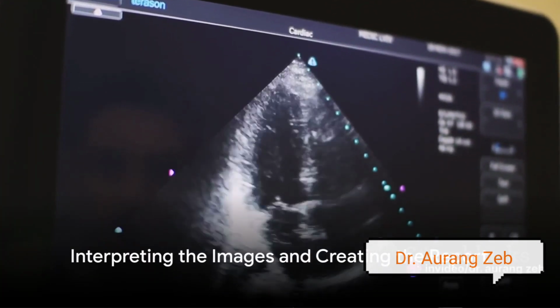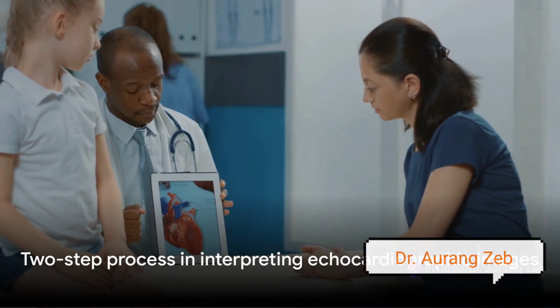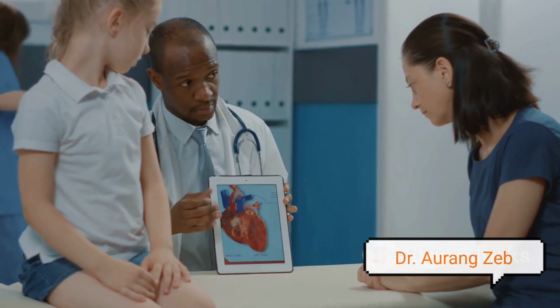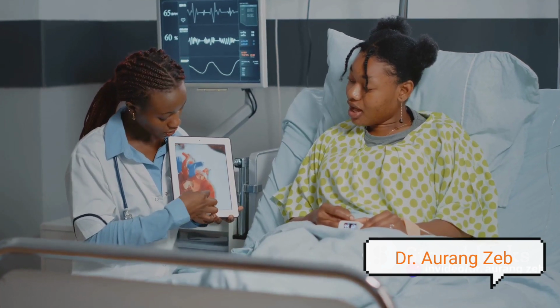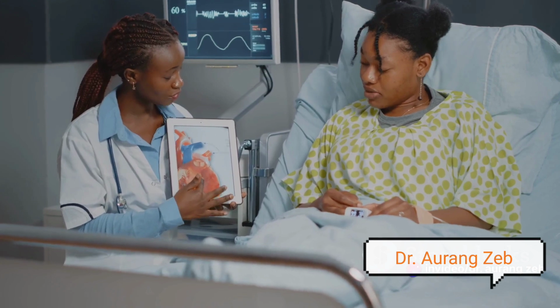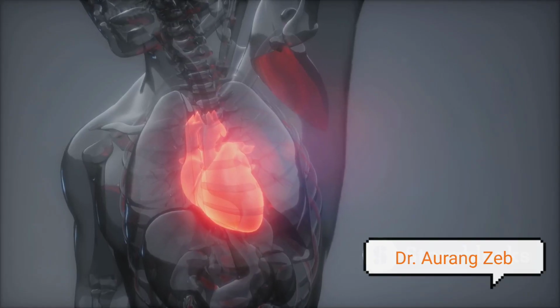Interpreting the echocardiogram requires skill and knowledge. Let's delve into how this intricate process unfolds. Firstly, the interpretation of echocardiographic images is a two-step process. The first step is identification, where you need to recognize the anatomical structures and the echocardiographic views. The second step is analysis, where you assess the function and condition of the heart structures.